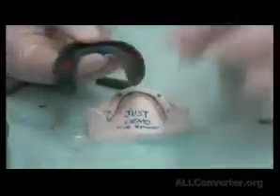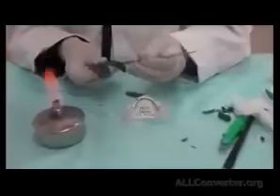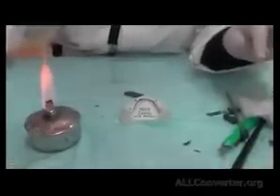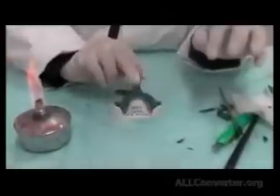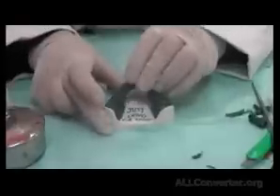This is excess material. I could simply remove it with a heated instrument going down here, and I only leave the material inside the sulcus. I don't want excess material. I could repeat, go in, warm it, and press it into place, and this is the lingual pouch recorded on both sides.